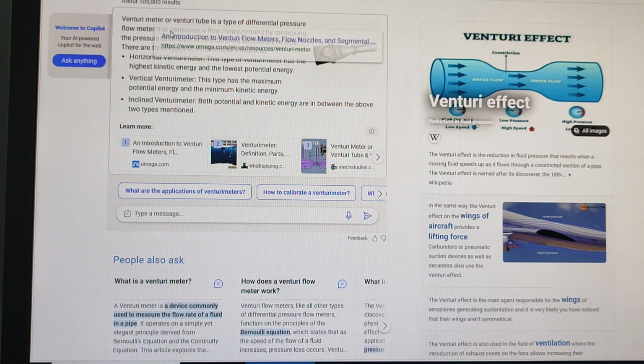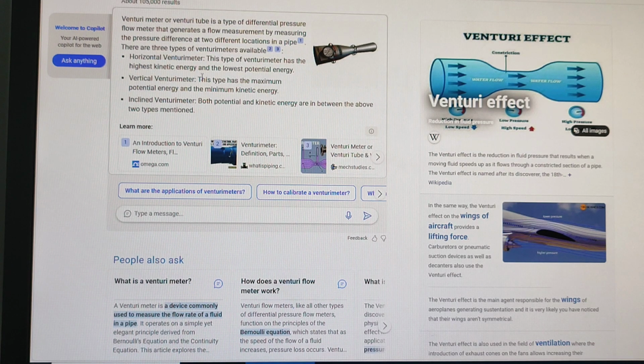Okay. So the Venturi principle, imagine that you have a high flow of oxygen or air or whatever gases. We studied this one in university. This is the pipe, and we have a very high flow of gas from here. And in here, let's say I have a small tube connected. So by the high flow from this gas or air or oxygen, it will suck whatever gas is here. So this is the Venturi principle. Is it clear?